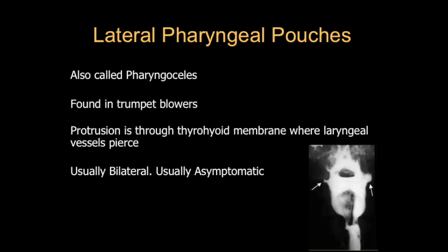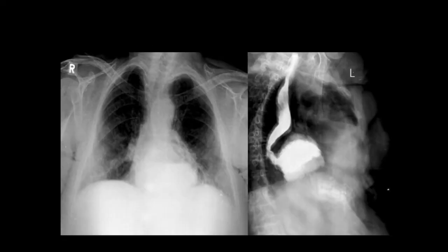The next case shows two small outpouchings on either side along the lateral aspect of the pharynx — these are lateral pharyngeal pouches or pharyngoceles. They are usually found in trumpet blowers and are asymptomatic, representing protrusion of pharyngeal mucosa through the thyrohyoid membrane where laryngeal vessels pierce. They are usually bilateral and most often asymptomatic.